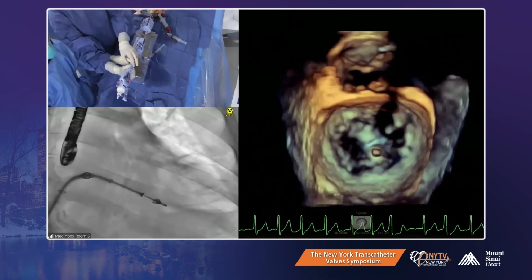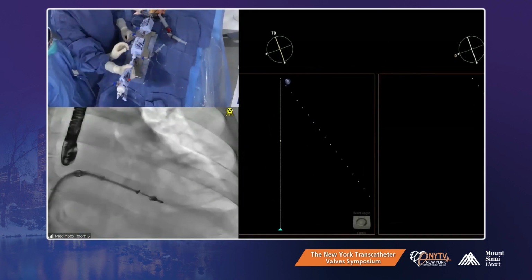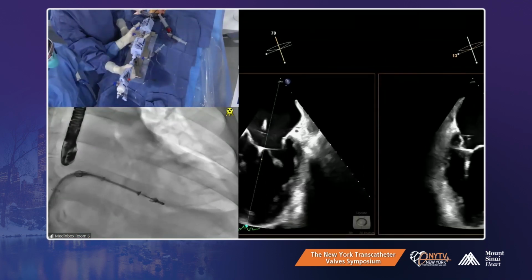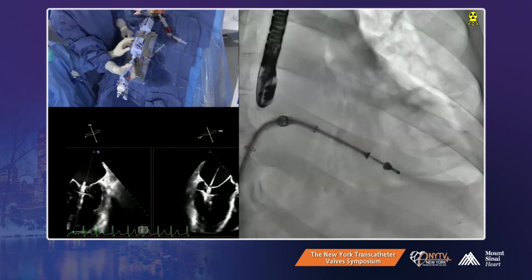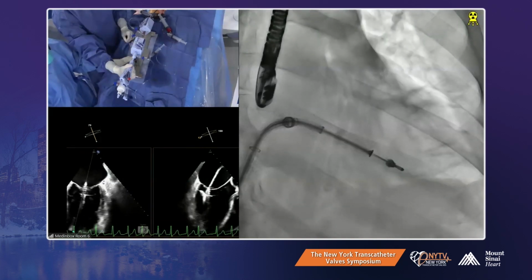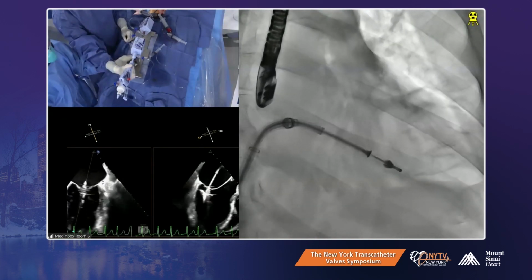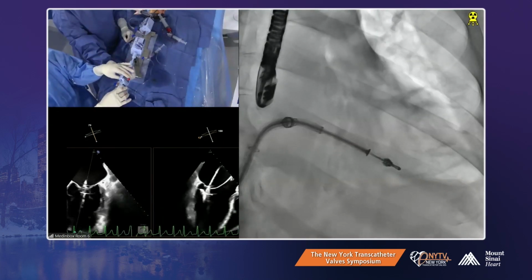I think I would push it in a little. I would be more central. We did. I think we're caught on the posterior. Just one moment. There you go. We can go a little bit more central. That's fine. You have less anterior now. Cords in the middle of the valve. And since you're using a wider clip, you're getting caught with this.